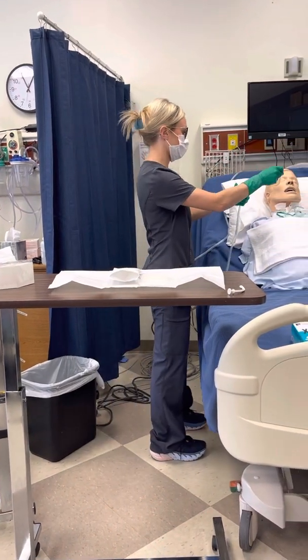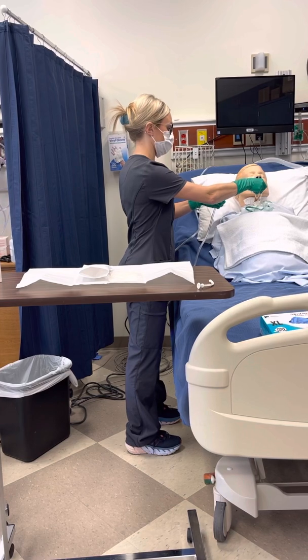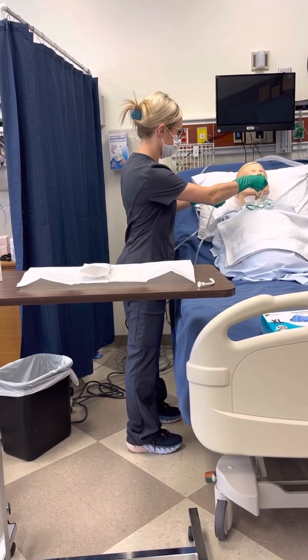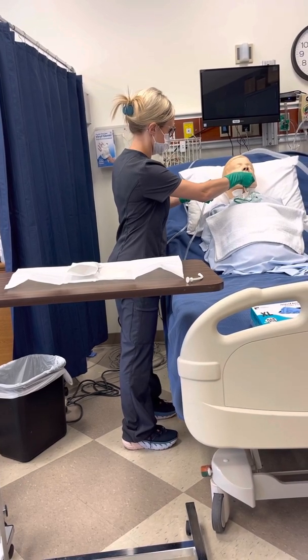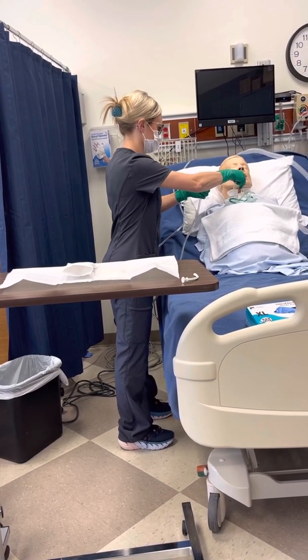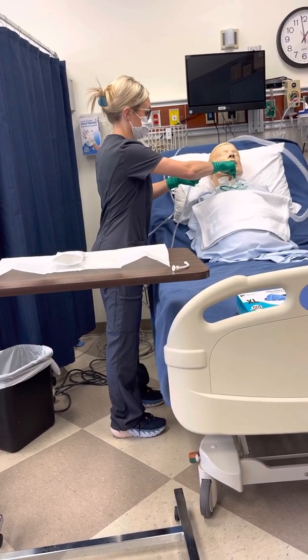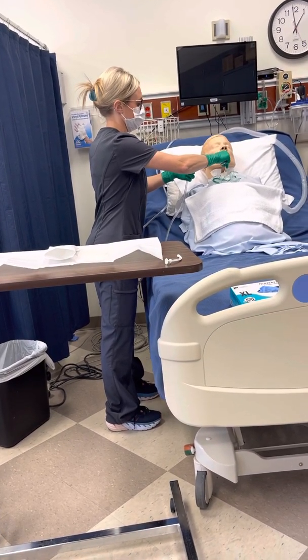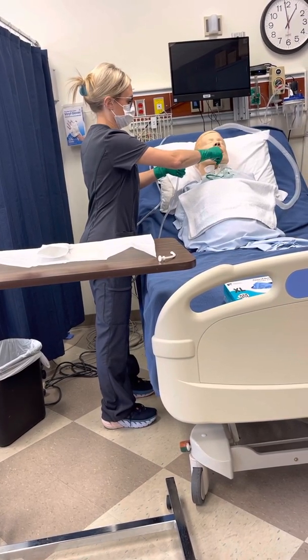And when doing this, like I said, I'm going to go down until I meet resistance or until my patient coughs. Again, Mr. Jones, if you cannot tolerate this, make sure to raise your left hand, okay? So I'm going to go down. I have met resistance, and I'm going to do intermittent suctioning, 10 to 15 seconds out.